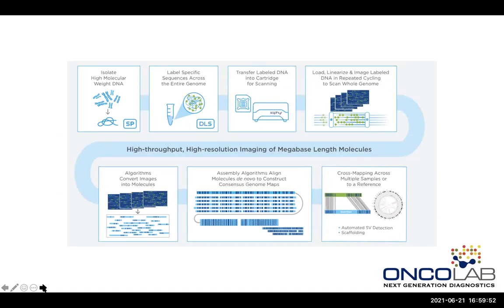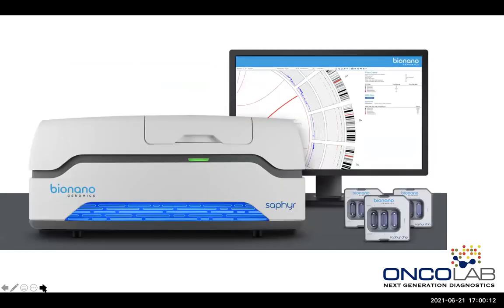So I very much wanted this instrument, but it isn't the be-all and end-all. It's not going to replace FISH and cytogenetics in a lab, which is what one would want at the end of the day. Also, the other detractor here is that in the United States, they have a very competitive pricing schedule for these chips, where one pays for a whole genome about between $450 and $550, and you have to do no karyotyping, no FISH on that.